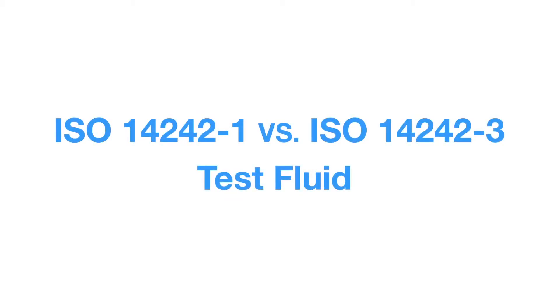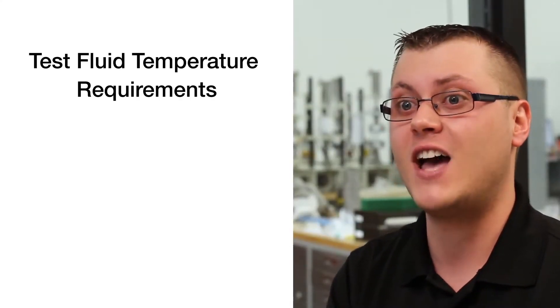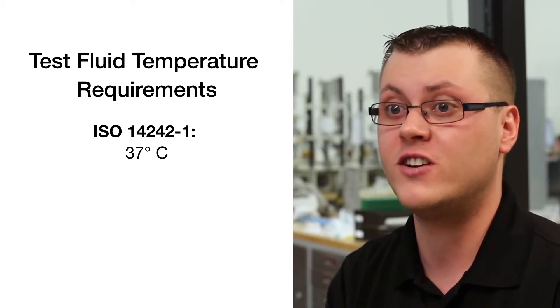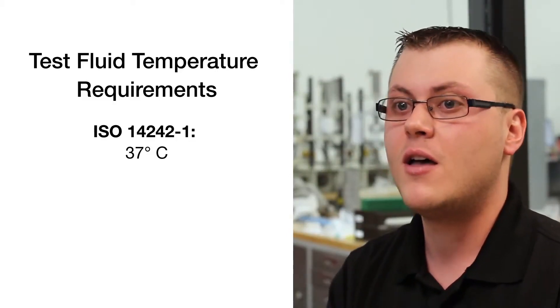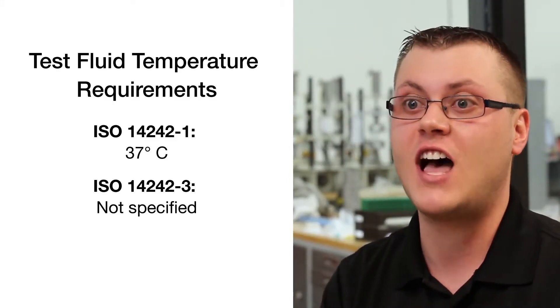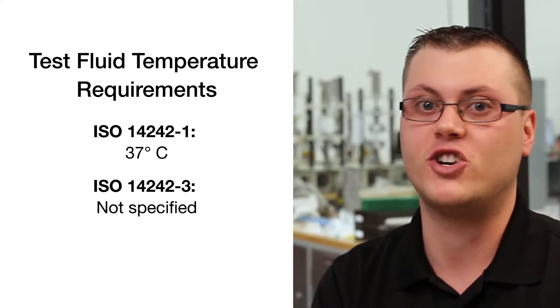Not only do the two ISO standards differ in the type of motion profiles they use, they also differ in the test fluid setup as well as the temperature that they are controlled at. ISO 14242-1 calls for the fluid to be heated to 37 degrees C, which is body temperature, while Dash-3 does not call for temperature control.